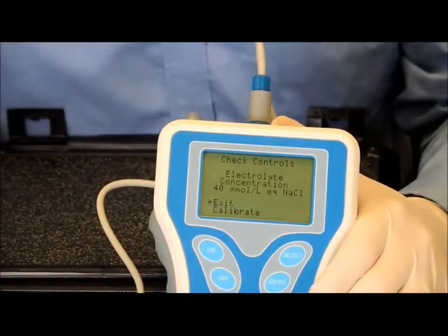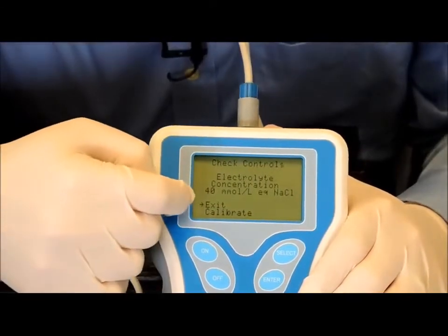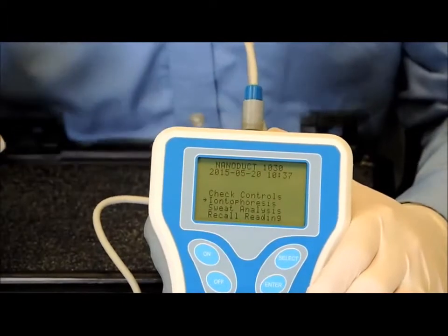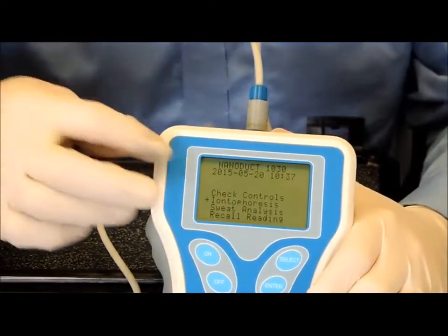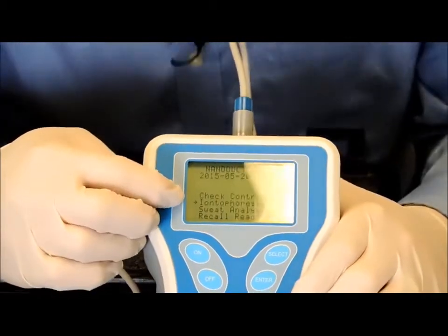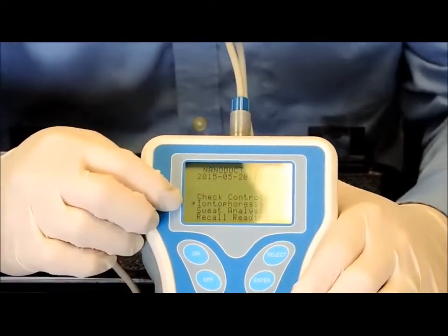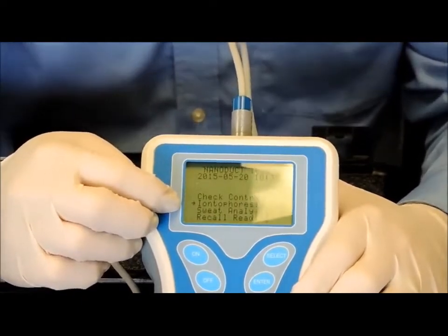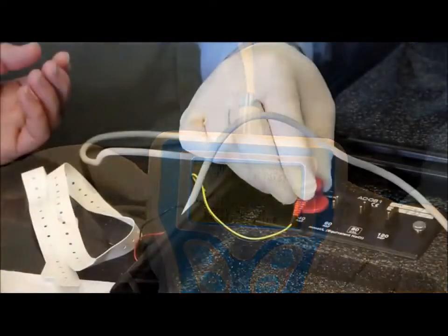So after calibration, the arrow is pointed toward exit. And I just hit enter, and that will take me back to the main screen. You'll see now the arrow has moved down from check controls to iontophoresis. And this is where we'll bring in the patient to perform the iontophoresis, the first step of the sweat test.